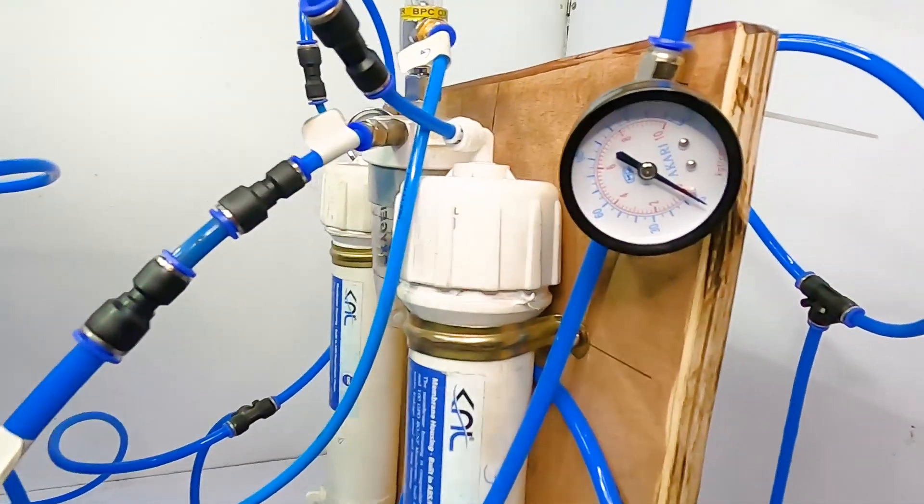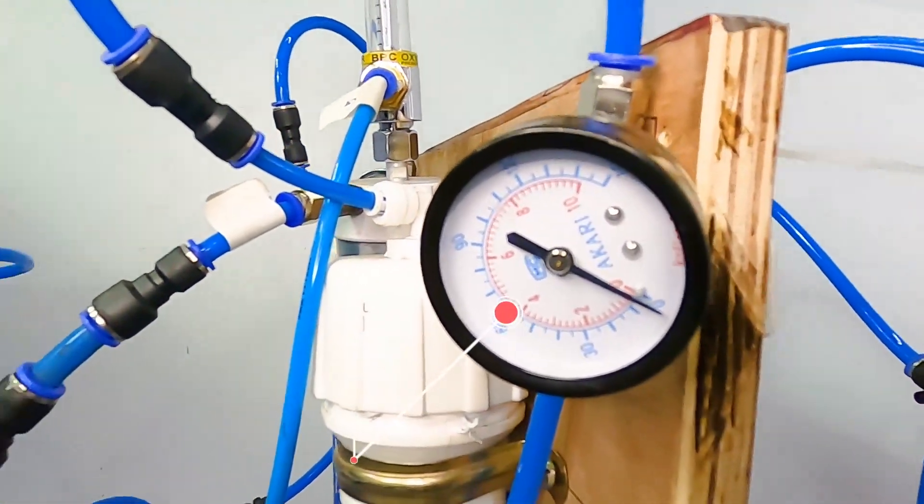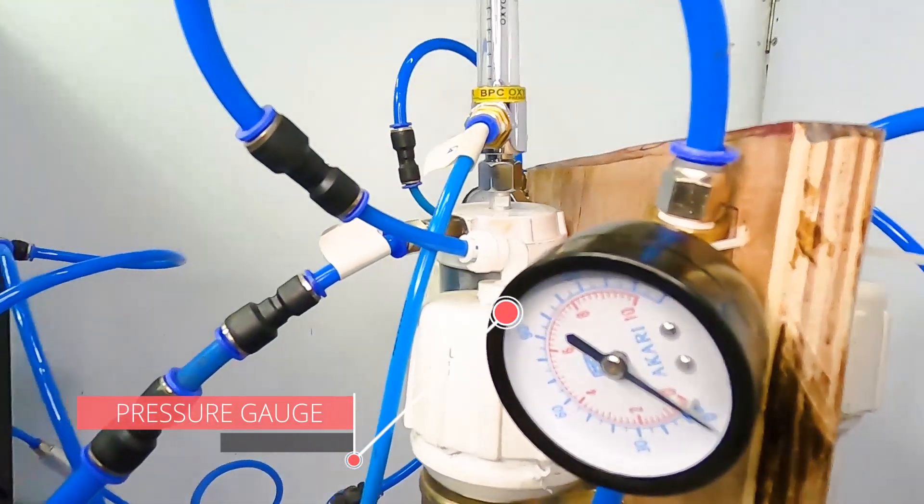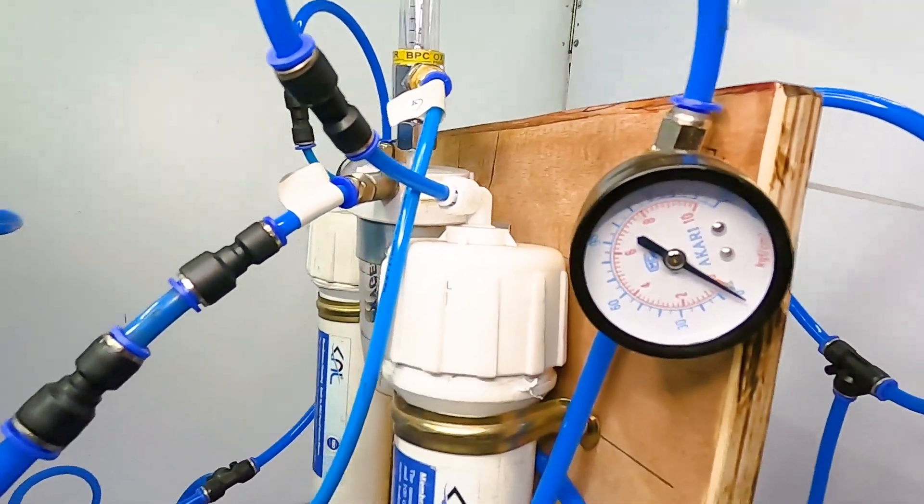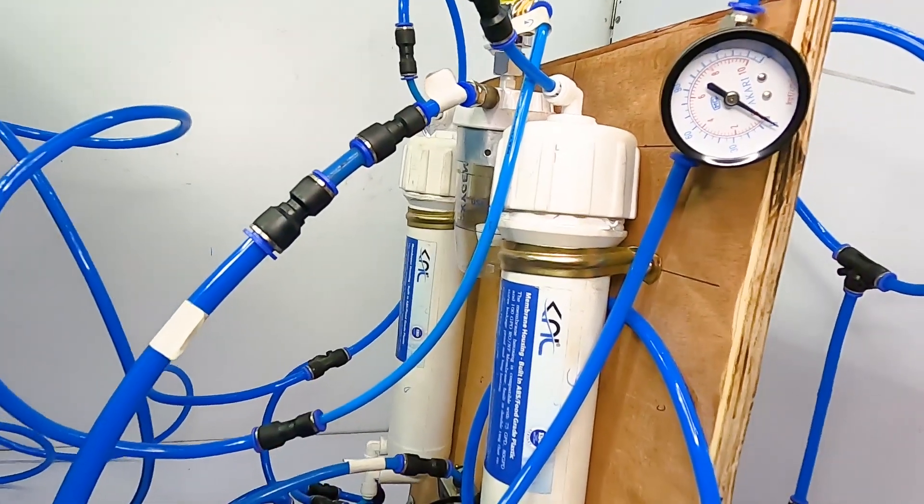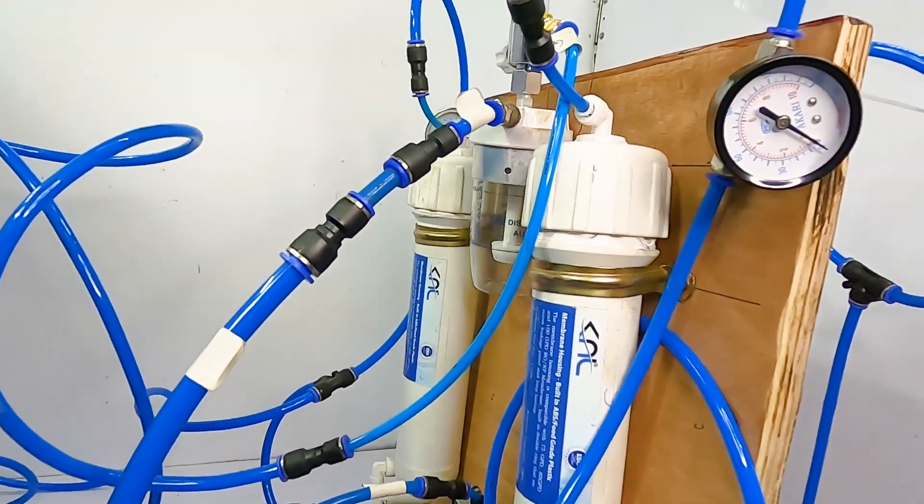And these gauges that you see here are used to check the air pressure that is in the cylinder. We need to ensure that the air pressure is around 30 psi for this operation to take place.